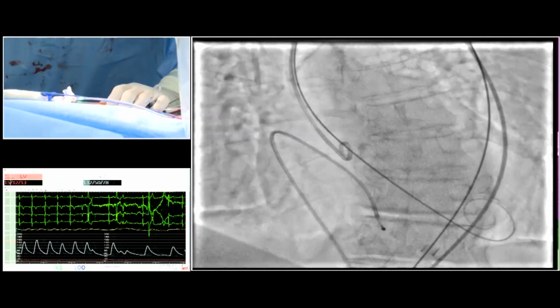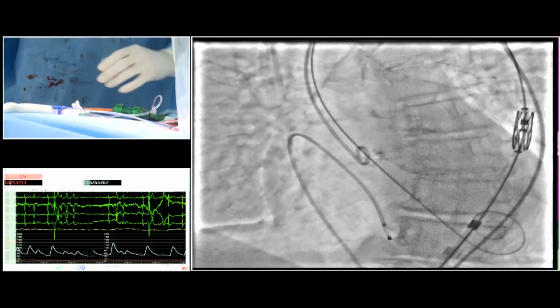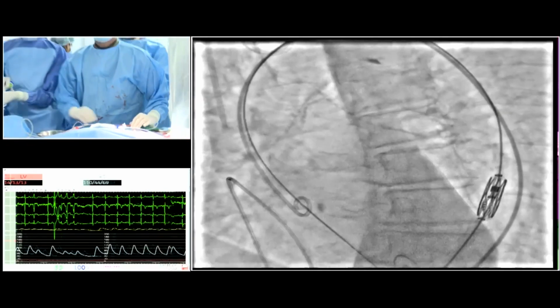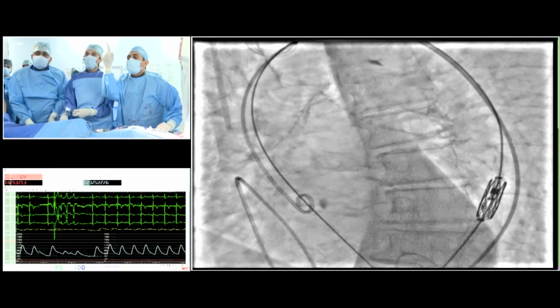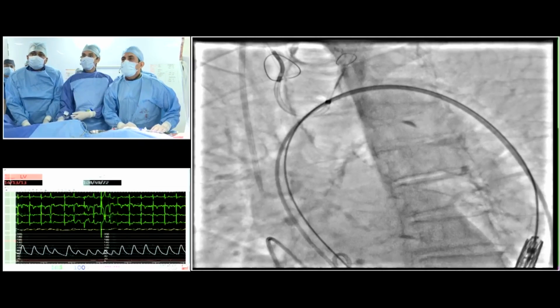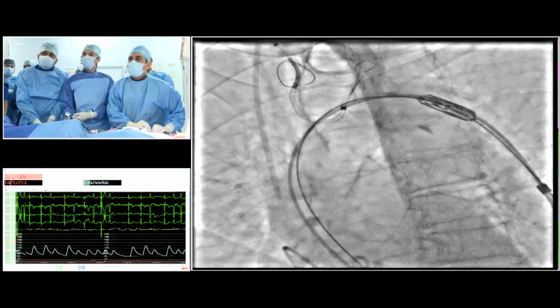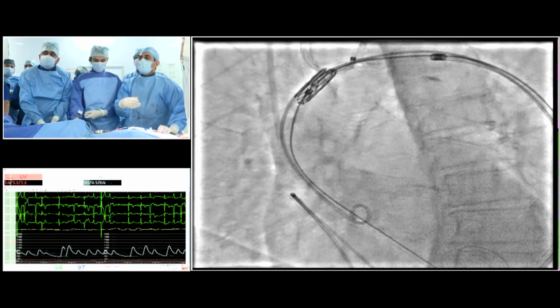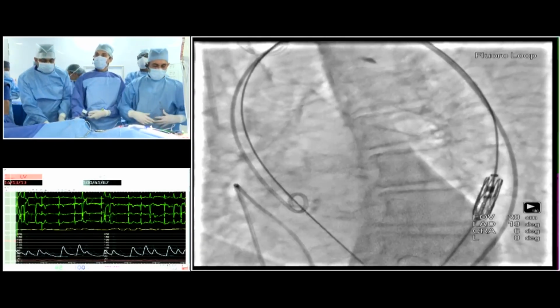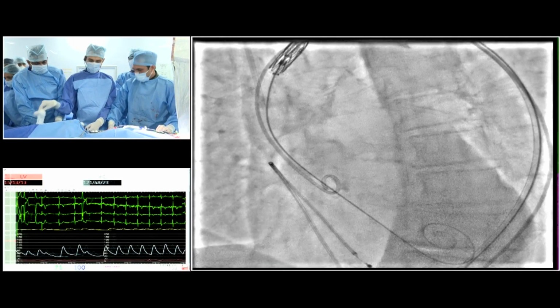So you can see the sheath tip and the wire both in the same view, and here's the octacore valve which comes. Let's go to the LAO, please. Okay, just flex a little bit so that we make sure it's not interacting with the cerebral protection Sentinel device. Also, for the operator going from the Myval to these octacore, it's much more simple in terms of markers. Let's go targeting the deployment angle, 80-20, even 85-15. I'll see what the operator is doing in this case.